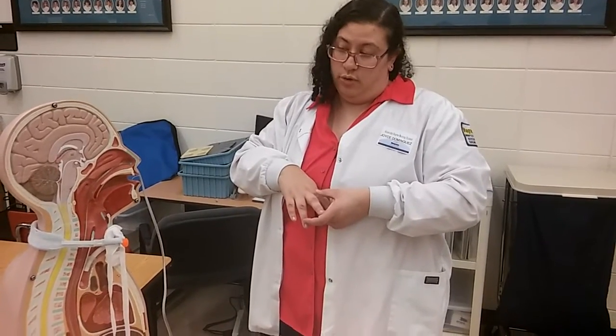Hi, my name is Joyce. Today, can you tell me your name and your birthdate? We're then going to explain the procedure — today we're going to be irrigating your NG tube.